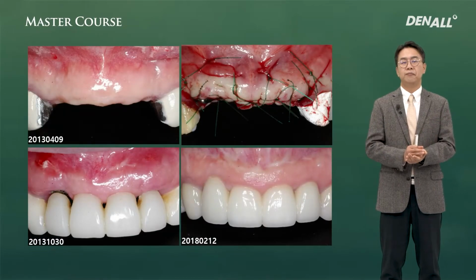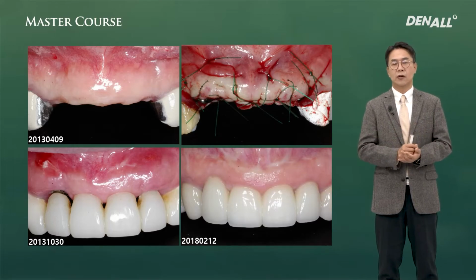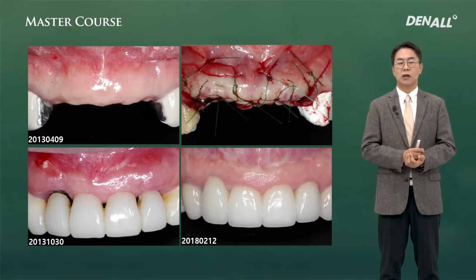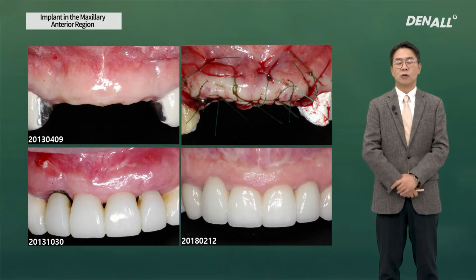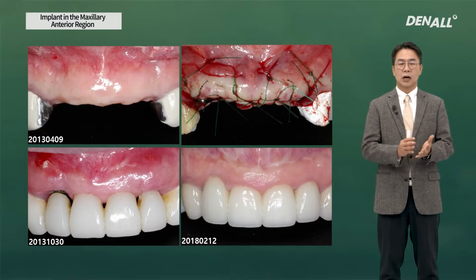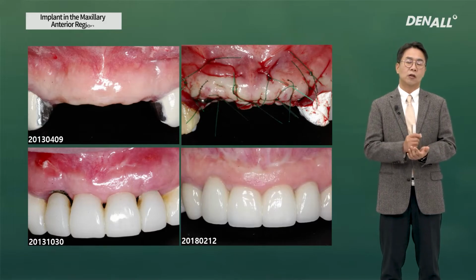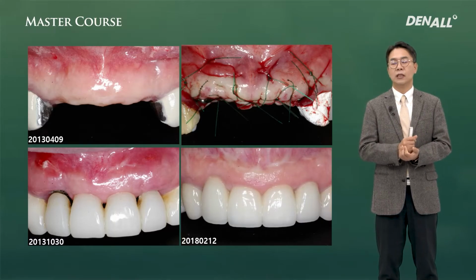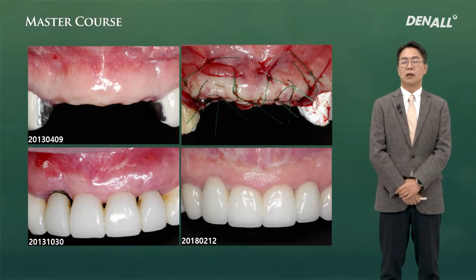Here you can see a lot of tooth loss in the upper anterior. Soft tissue and hard tissue status was checked and implants were placed. If you look at it here, the contour is dramatically changed. A temporary prosthesis was used before final prosthesis. And the position of number 2 compared to the original plan is type 2 gingival line, the aesthetic line, which was explained before, but overall the prosthesis looks okay.